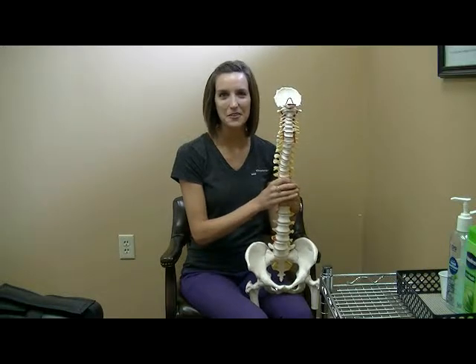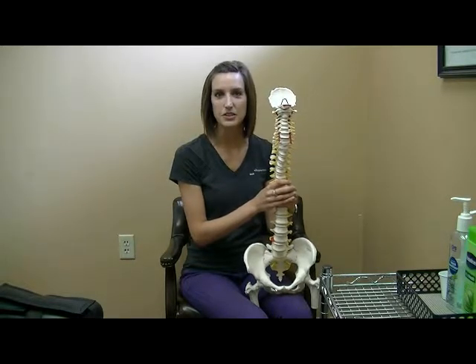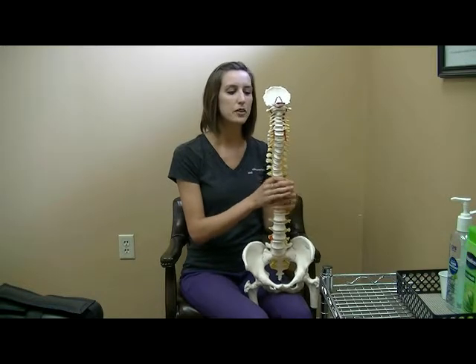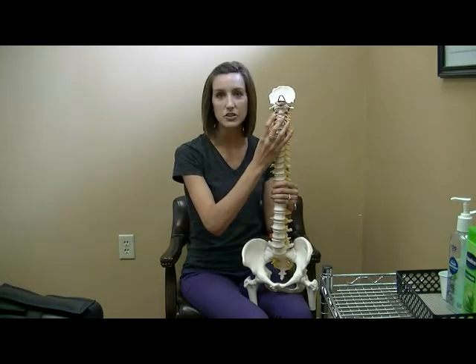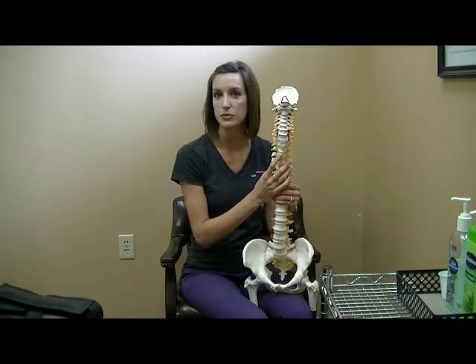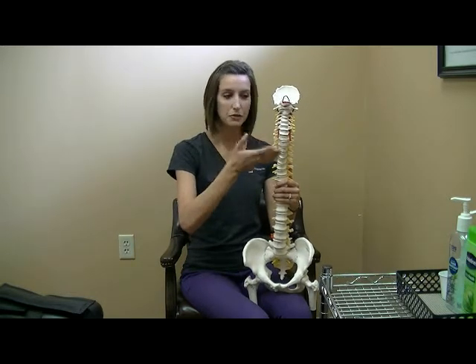I'm Dr. Mandy Wyant with Family Chiropractic and Wellness, and I wanted to take a moment just to talk about a couple of things that we commonly see with patients, both on x-ray but also with a good hands-on exam. So for a lot of people, they've never had x-rays or MRI or any sort of imaging done, and if they are having a lot of neck issues or upper back issues, I do like to usually get a look at that area. So from a straight-on view of the neck, upper back area, you would be looking at yourself here from front to back.